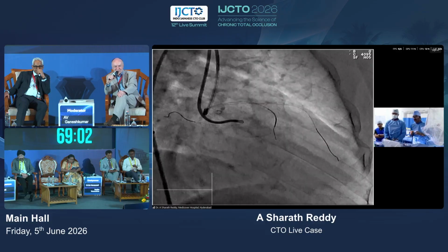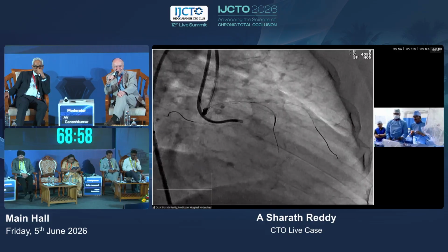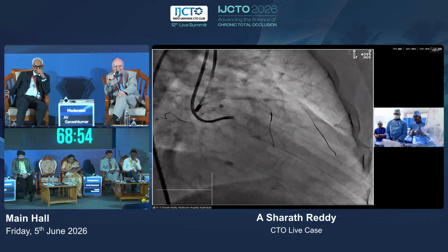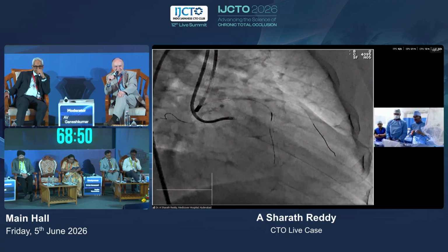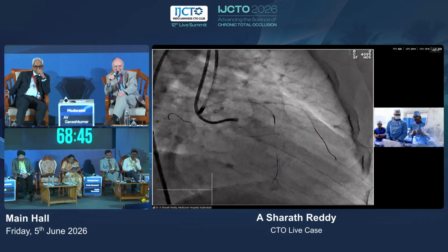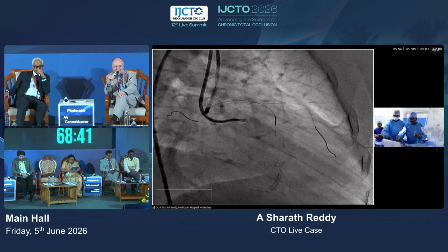So comment what you do. With a heartbeat, advancing the wire on the reference and through. Yeah. Okay. We crossed.